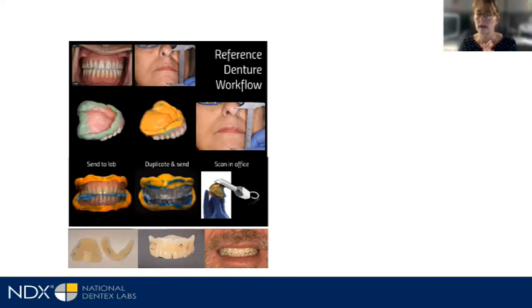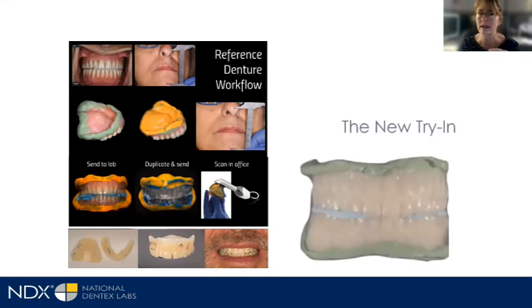Now, I have been told that, really, it isn't the scanner making a difference, it's my eyes and my mind going slow enough. So what I do is I take a Dr. Thompson stick. It has an indelible, watered ink on one end. I'll just use the maxillary arch as an example. I will make an arrow down the midline, and a couple X's at the post-dam area. Hopefully the patient has well-developed rugae, which also helps to capture intraoral scans. And then I follow those lines and I follow the X's. So yes, my mind is going slower and I am methodically following the lines that I've created. Otherwise, when you look at the screen, it's all pink, right? It's all gingival tissue, and it's difficult to discern exactly where you are in that scanning process.